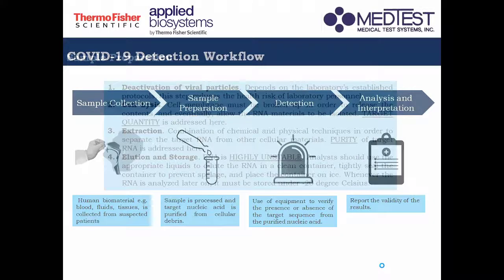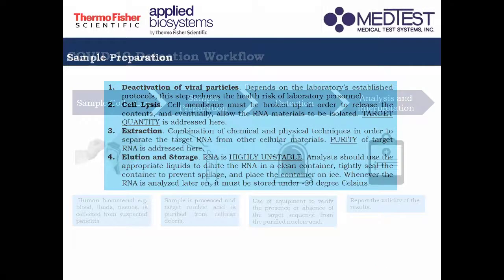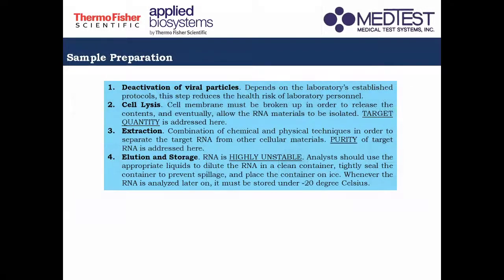So for sample preparation, this involves mainly these steps. So the first one I want to discuss is the deactivation of viral particles. So may mga laboratories na nagkakandak or has their own protocol in deactivating the virus prior to processing them.